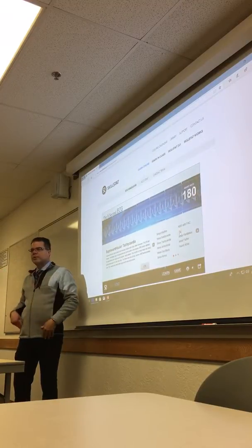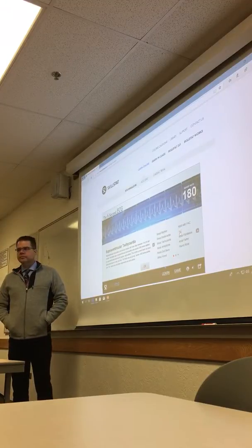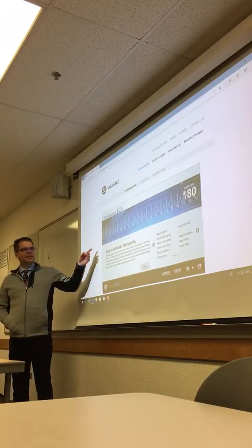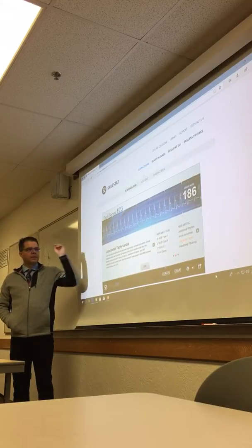And so then that's when they would be able to define it. SVT has no P waves, and then the junctional tachycardia does have P waves. The junctional does not have P waves, except it can occasionally show them, but they're going to be inverted. Right, but this one has P waves. See, this one does not, it's flat.